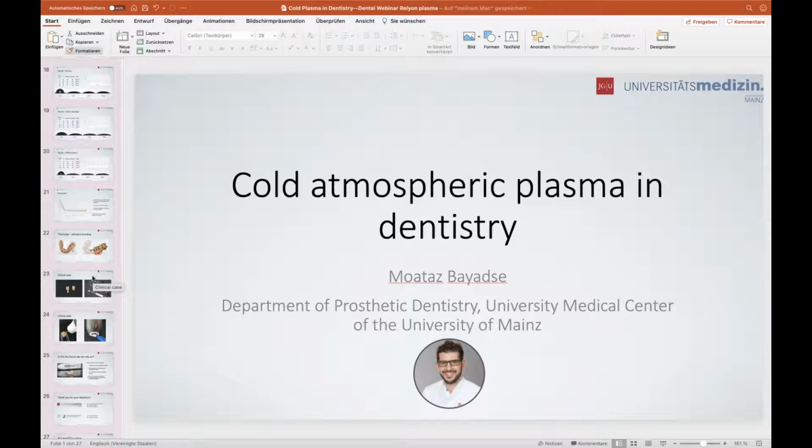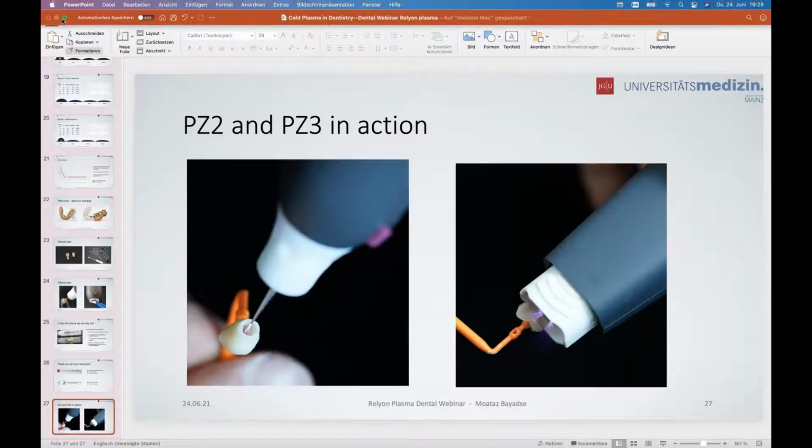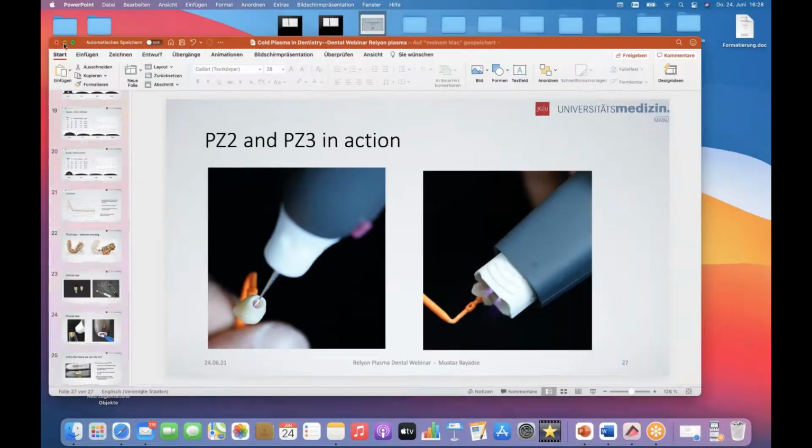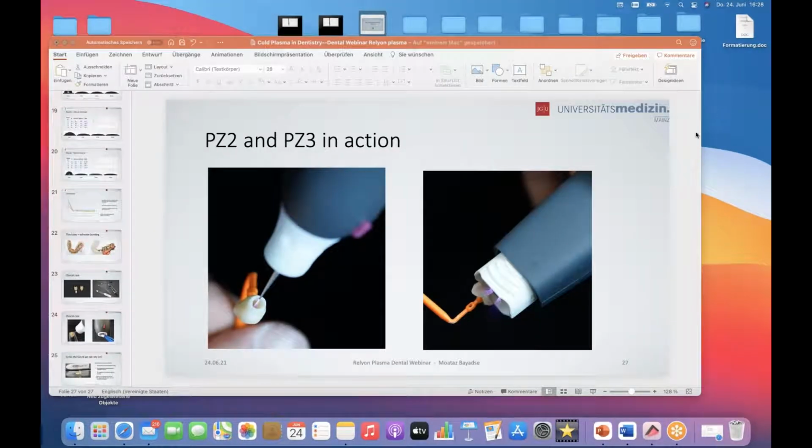Okay, so hello, my name is Florian Freund. I just also want to answer this question. As Mr. Bayatze already told you, you can recognize a reduction in the hydrophilicity at 1 day, for instance. As we have shown in our last webinar, the main reason for the increased hydrophilicity is the reduction of carbon and other adsorbates on the surface. So it depends on your environment how fast the recovery is.